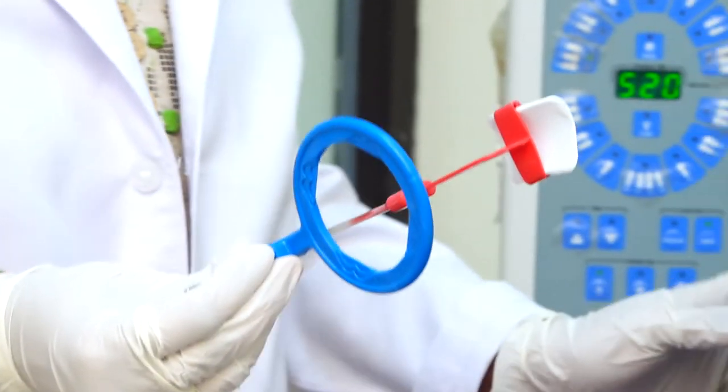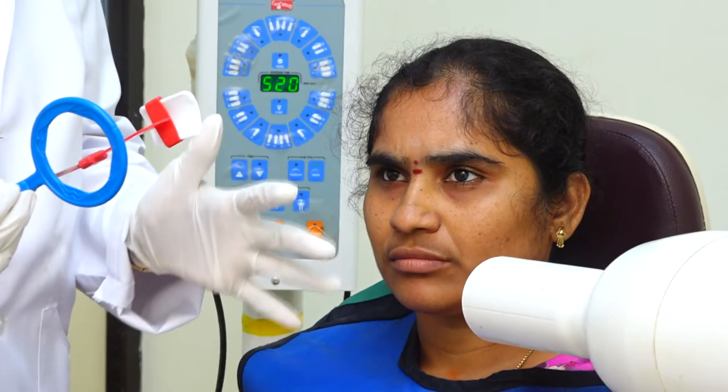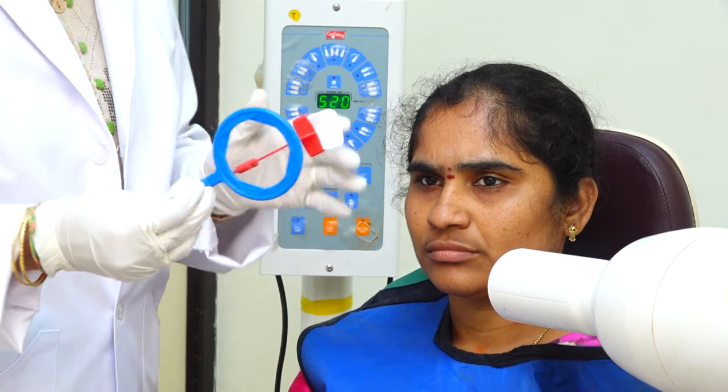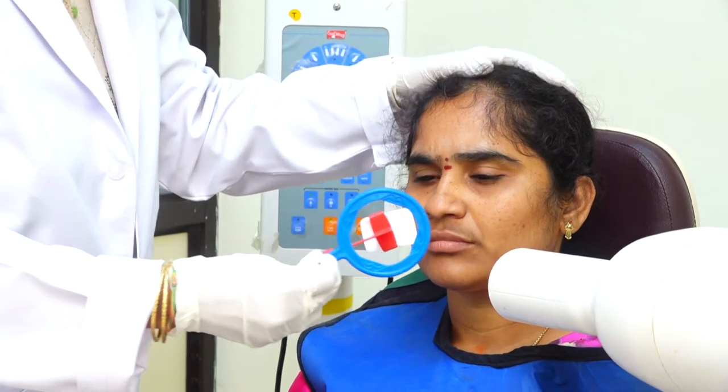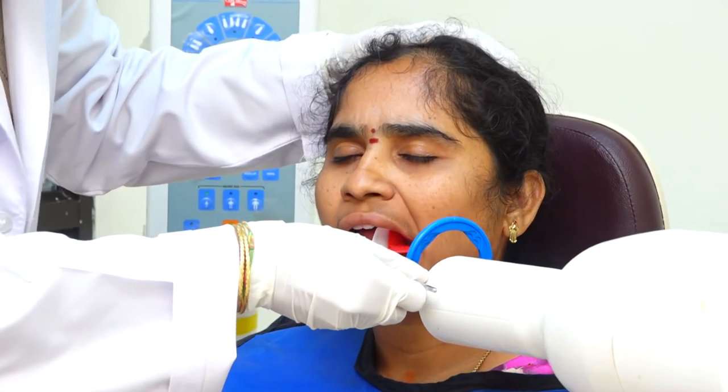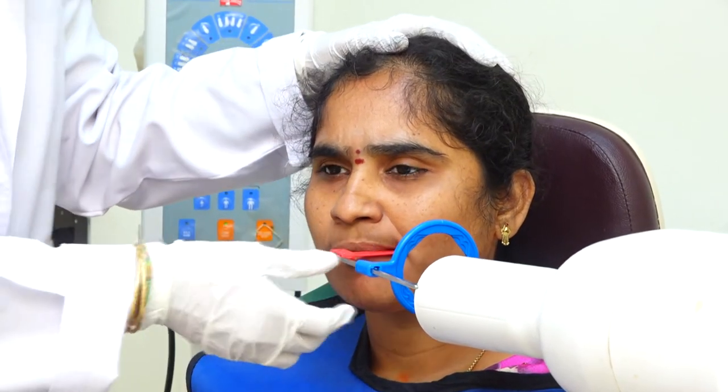Once the patient sits on the dental chair, greet the patient and ask on which side you are going to take the bitewing radiograph. Please make sure to arrange the tube on that side. I am going to take on the left side, so I will ask the patient to open the oral cavity and ask the patient to bite on the bite plate.